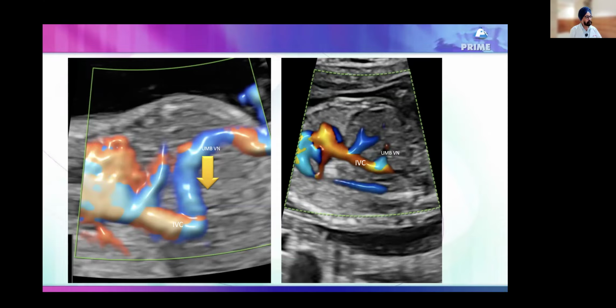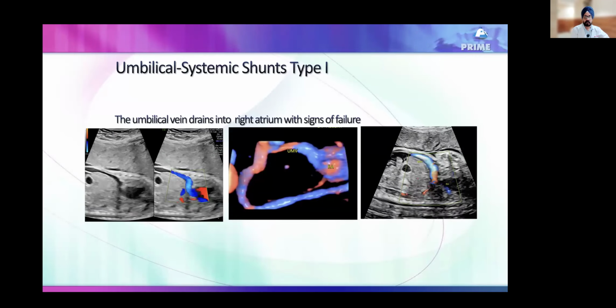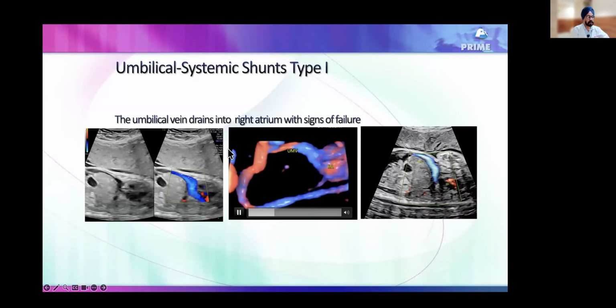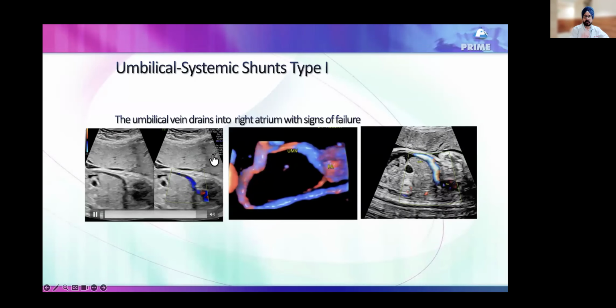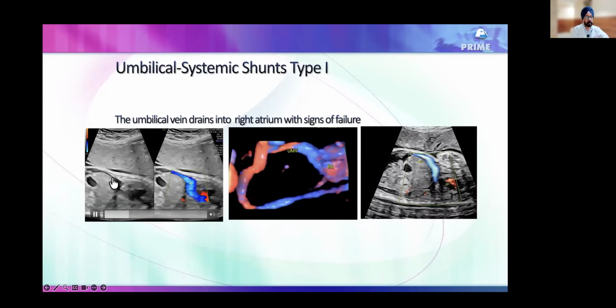Why do I know all this about scimitar? Because I presented a video on scimitar. That was one of the self-inflicted CMEs, right? Apart from this, you should not be looking for any PAPVC in isolation. I have one case, but I deleted it. I don't think so. We want to show it, and that's something which is abnormal.